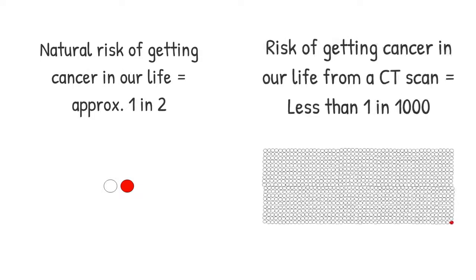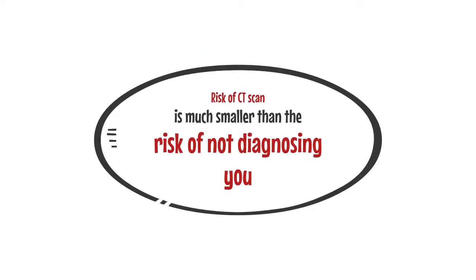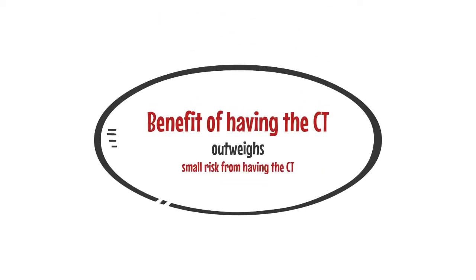The natural risk of getting cancer in our lifetimes is approximately 1 in 2. CTs are typically associated with an additional risk of less than 1 in 1,000. Almost everything we do in life comes with a risk, and the CT you are having is to help to diagnose a health issue. It has been determined by 2 healthcare professionals that the risk to you from having the CT scan is less than the risk of not having the exam. Another way to think of this is the benefit to you from having the scan outweighs the small risk of having the x-rays used to do the scan.